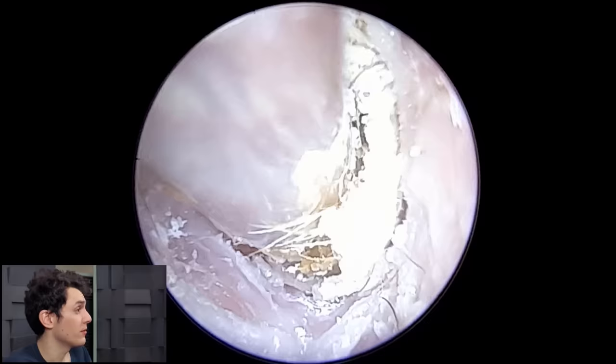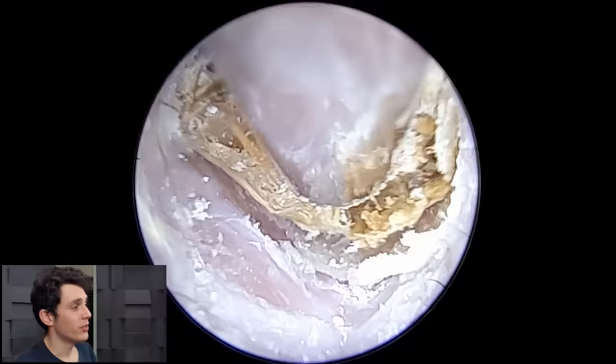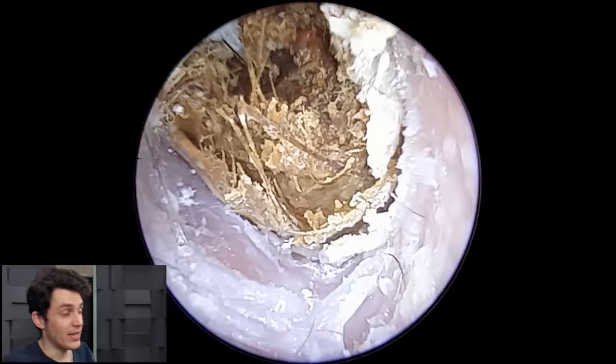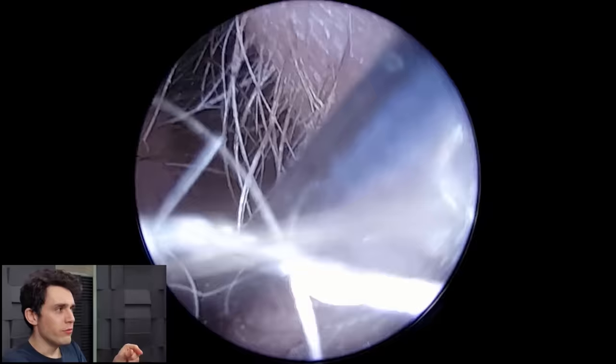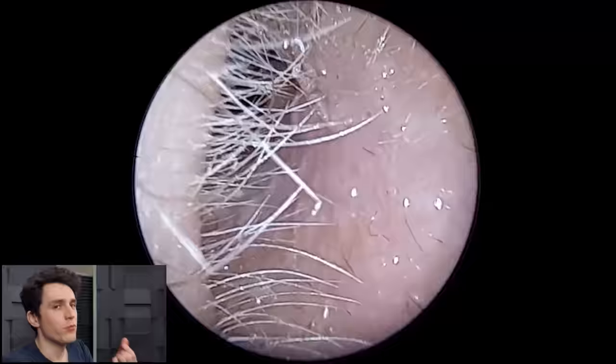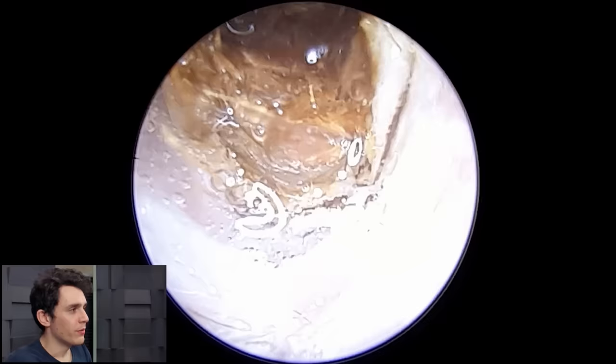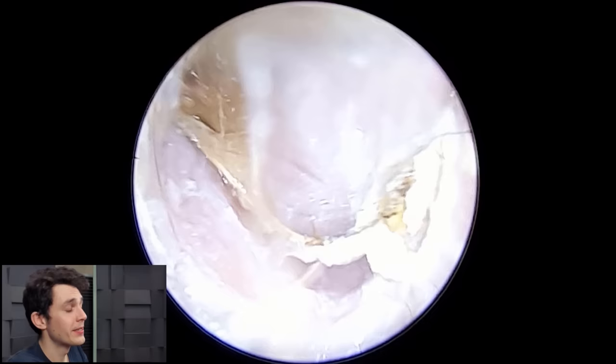So, similar principle here with the hair. We're going to try to essentially loosen this all up and free this plug so the patient can hear normally again. The reason I wanted to share this is because it's a very good, clear example of something we call acute diffuse desquamation, which essentially means the shedding of skin — and a lot of it. In this scenario 'diffuse' means it's happening in great quantity throughout the ear canal, not localised to one area.